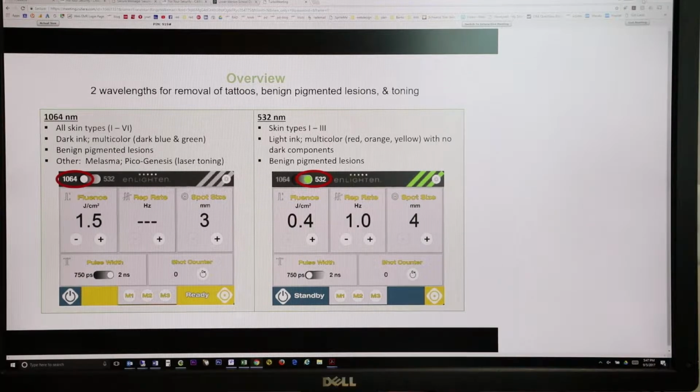It could be the setting was too high. It could be that the patient did not comply with the post-op instructions and went and did heat-related activities to further cause heat injury. And it could mean that they're susceptible to it. Their skin type is susceptible to hyperpigmentation whenever traumatized.